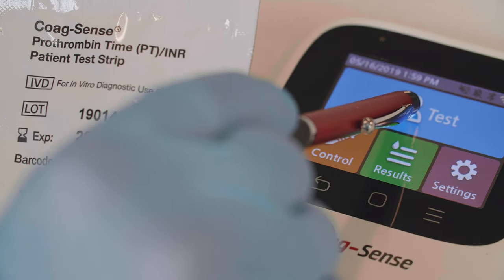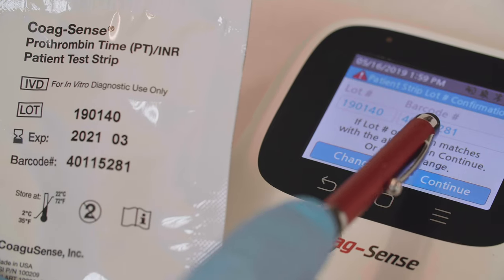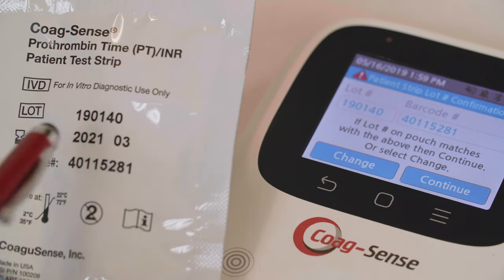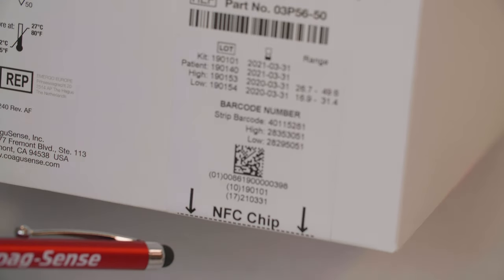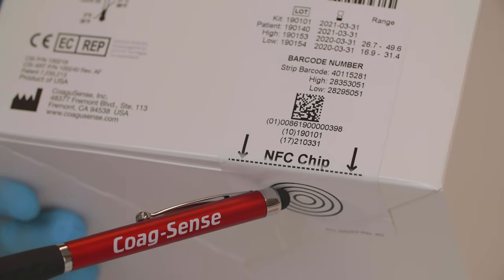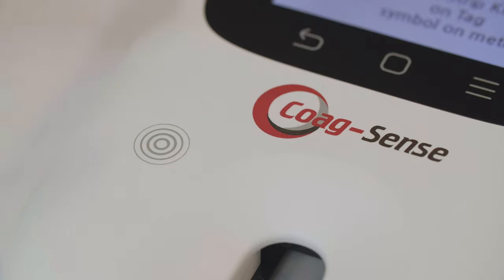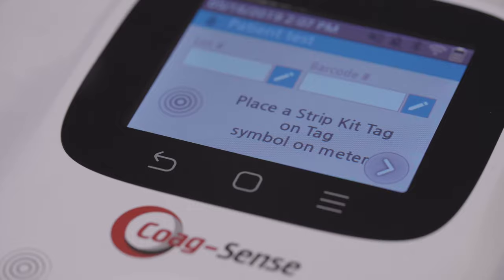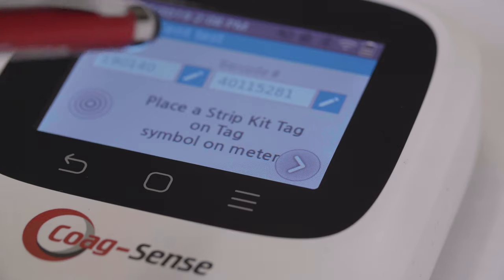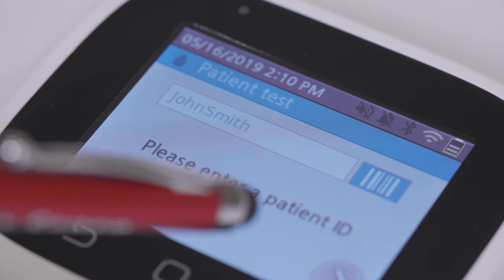Press the test button on the color touch screen. Confirm that the patient strip lot number displayed matches the lot number on the test strip pouch. If the number does not match or the field on the meter is blank, then touch the NFC chip located on your test strip packaging to the NFC target rings on the meter case. If the NFC chip is not available, then manually enter the lot and barcode numbers from the patient test strip pouch, then press the continue button. Enter the patient ID or scan the patient ID barcode using an optional barcode scanner.